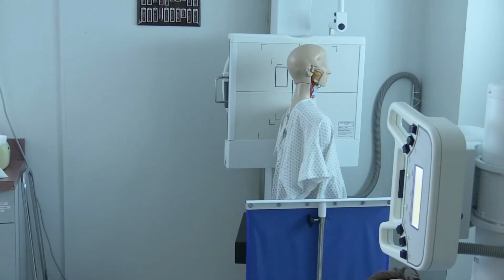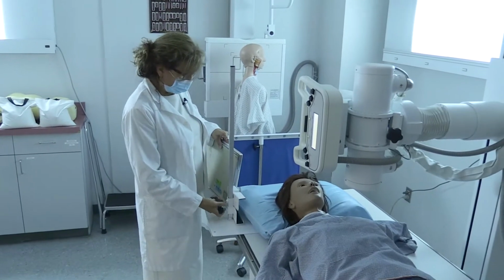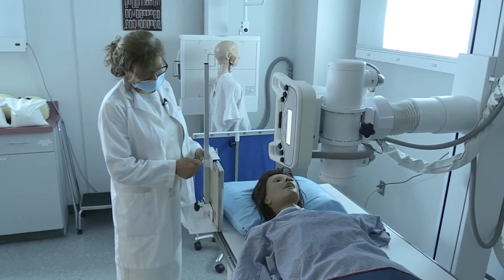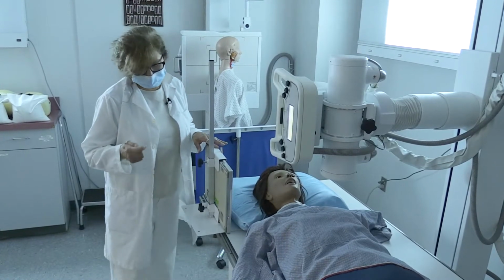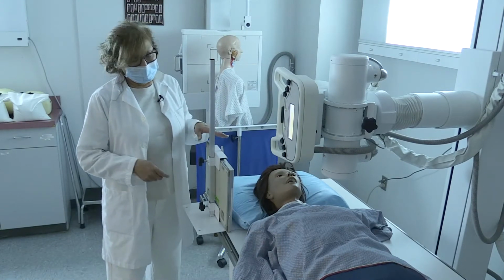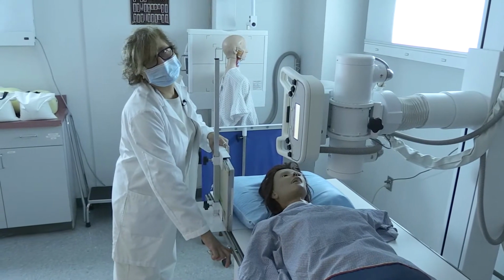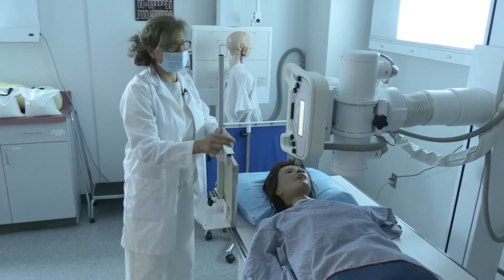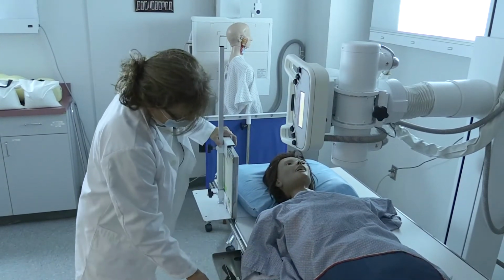I'm going to use my grid holder and place that this way. Now, if you're using the table for positioning, you may want to lower this IR with the grid below the tabletop, because we don't want to cut off the back of the spinous processes, especially in the lower portion of the C-spine.